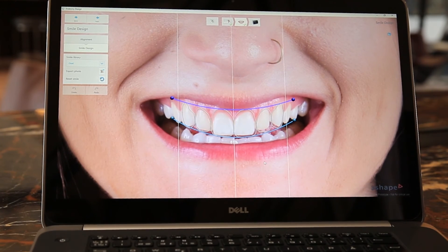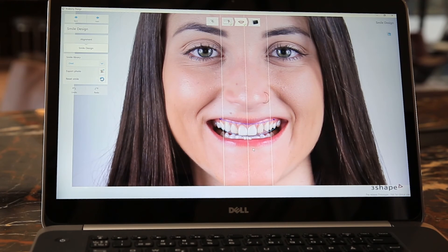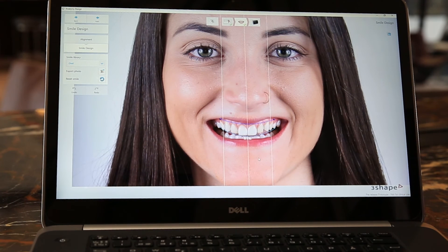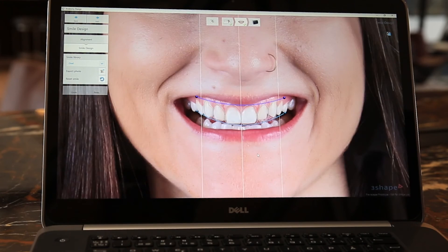In about 30 seconds I actually created a smile design for this patient. Now I can export the photo, bring it to the patient, discuss the treatment, and get acceptance.